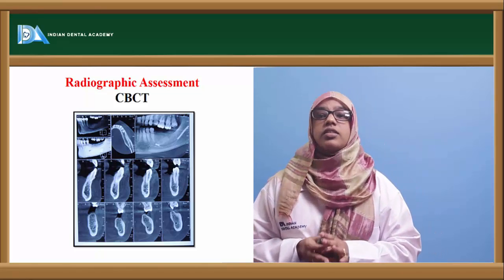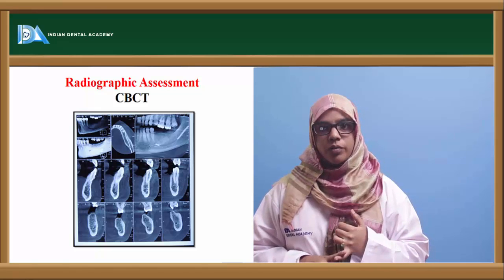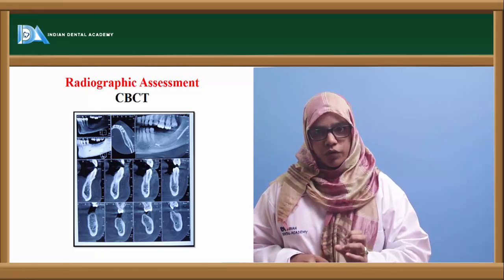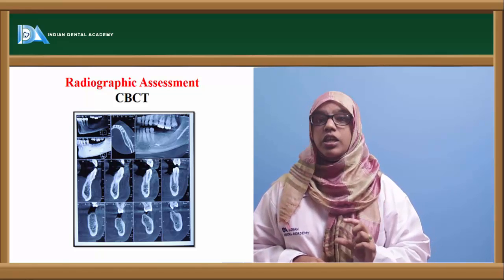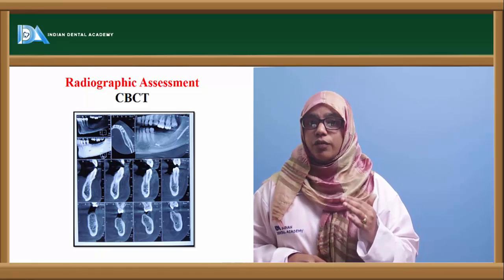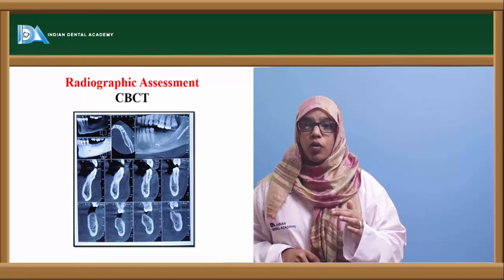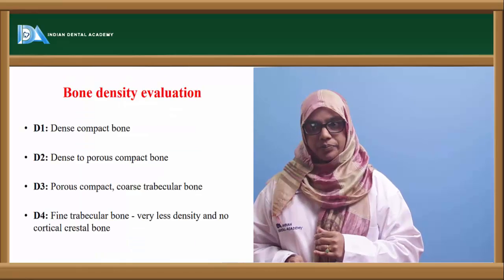Now CBCT is the need of the hour. It not only tells you the quality of the bone, it tells you the volume of the bone in all 3 dimensions. It will help you assess the height and the width of the bone, which will eventually help you select the proper width and length of the implant. It will also tell you the position of vital structures like the floor of the nasal cavity, the floor of the maxillary sinus, and the approximation to the inferior alveolar artery. It will also help you check the density of the bone and decide your treatment plan.